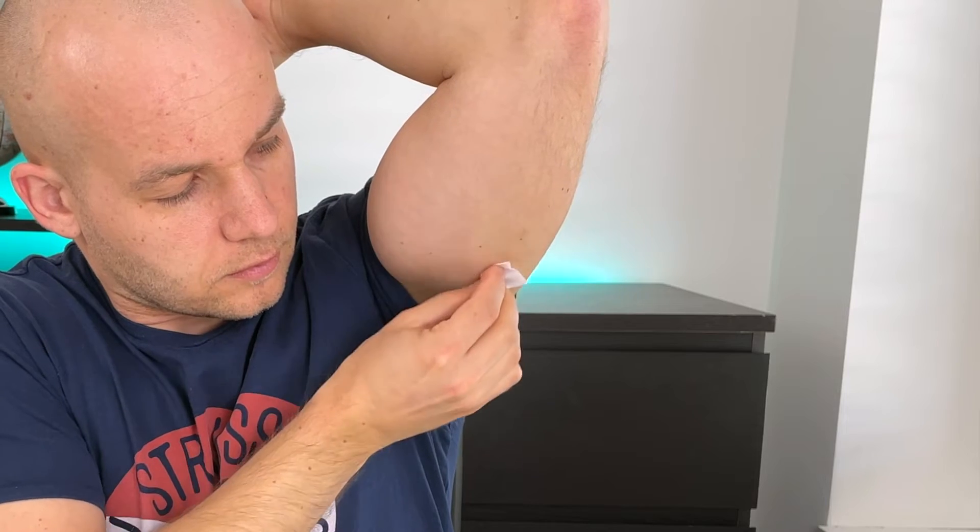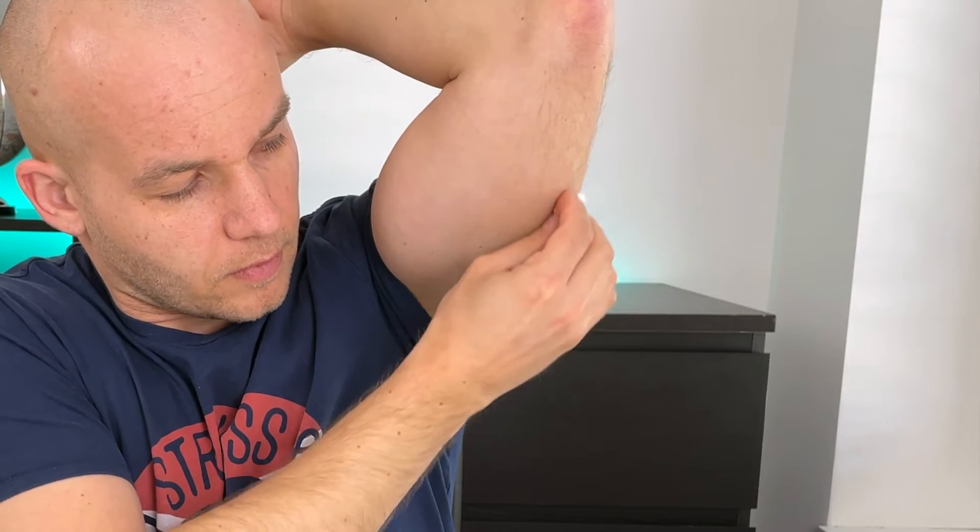Before you apply the sensor, make sure to wash your hands, clean the site with an alcohol wipe, and let it dry. Pro tip: always apply the sensor after you've washed your skin with warm water and soap, because you really don't want your skin to be oily. You want the adhesive to stick firmly and the sensor to stay on for the full 10 days. Oily skin makes this much more challenging.